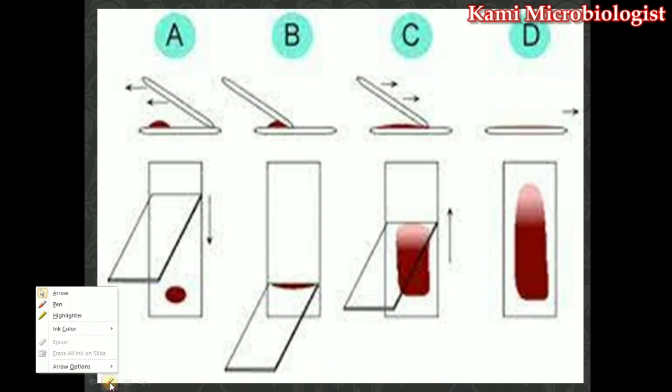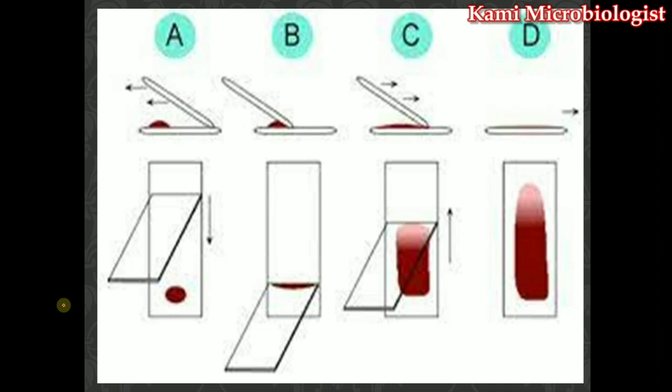Now another question arises in our mind: how can we make the smear or blood film? We can also call that a blood film, blood smear, or peripheral blood smear as well.